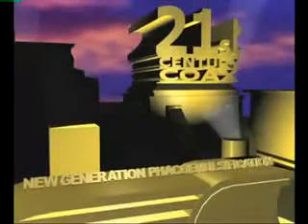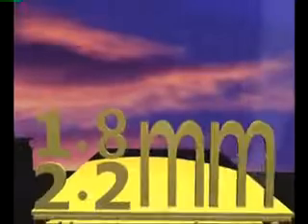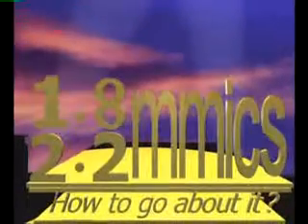21st century coax. New generation phacoemulsification. 1.8 and 2.2 mm MICS microincision cataract surgery. How to go about it.